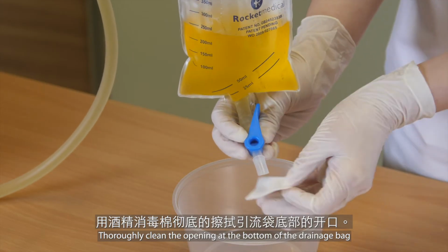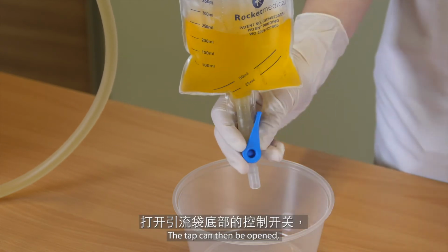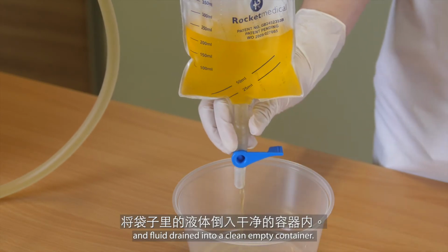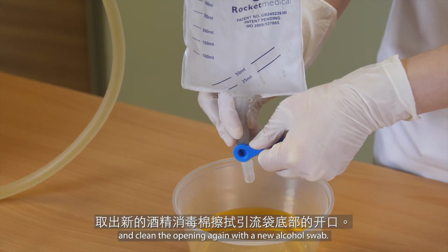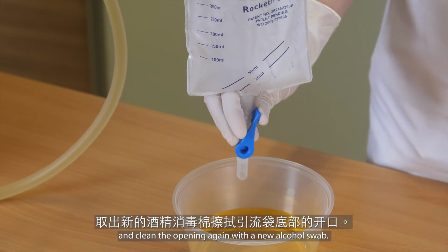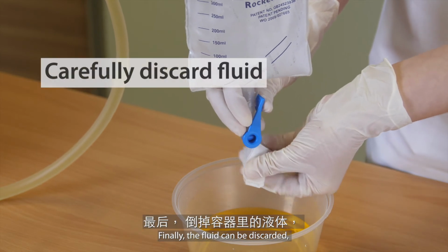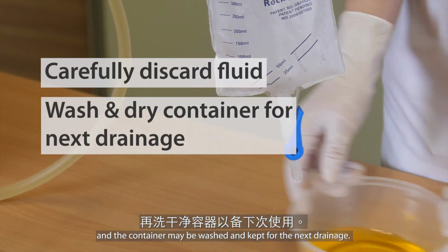Thoroughly clean the opening at the bottom of the drainage bag using an alcohol swab. The tap can then be opened and the fluid drained into a clean empty container. When drainage is complete, turn the tap off and clean the opening again with a new alcohol swab. Finally, the fluid can be discarded and the container may be washed and kept for the next drainage.